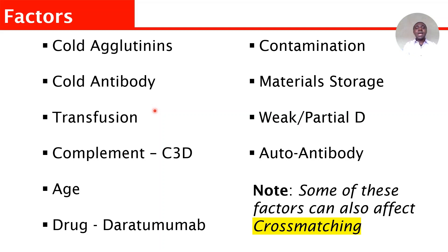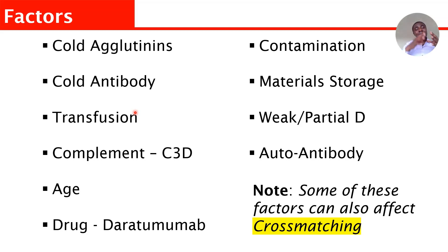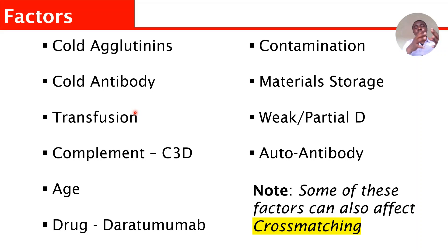Another thing that can affect it is transfusion. If somebody who is O positive receives O negative blood, in the patient's system there is D antigen (the patient is O positive) and there is D antigen negative (the donor cell, O negative). When you do the blood group, you will see that the patient cell goes up in the anti-D well while the donor cell comes down. This leads to what we call dual population.